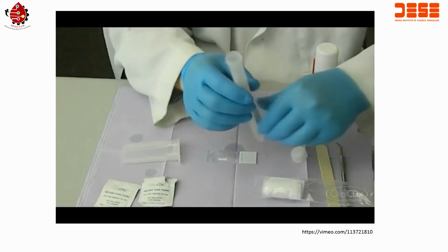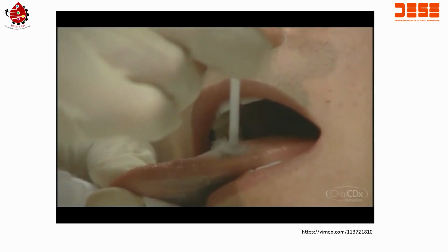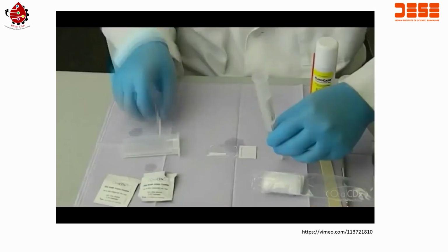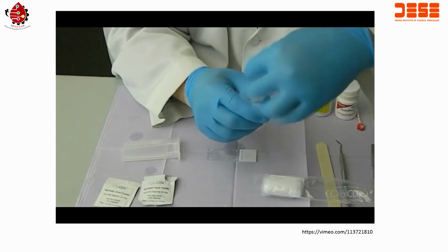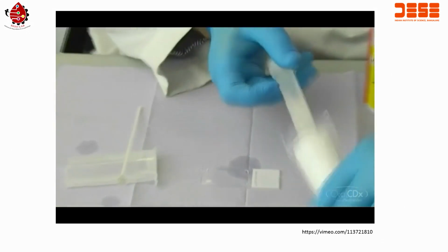Insert the brush into the vial for cell block preparation at the lab. Brush the lesion and obtain another complete tissue sample. This sample is not transferred to the glass slide, but instead, the brush is inserted directly into the supplied vial. Seal the vial and gently shake it. Then place it into the enclosed bag.